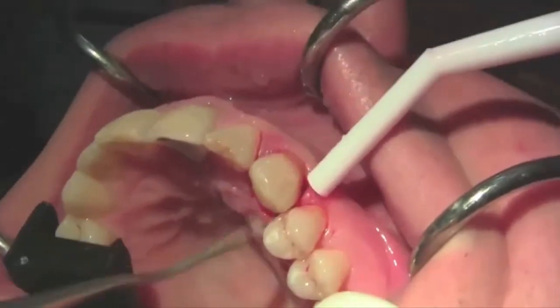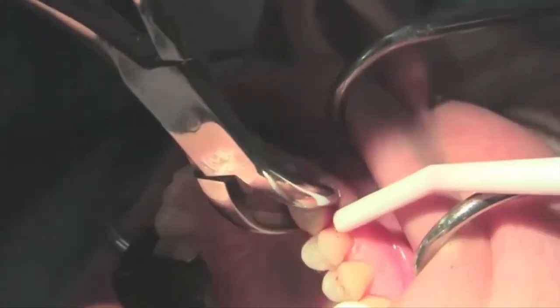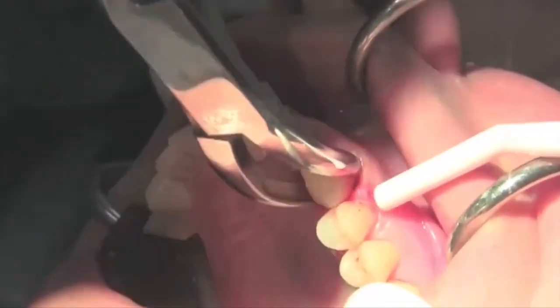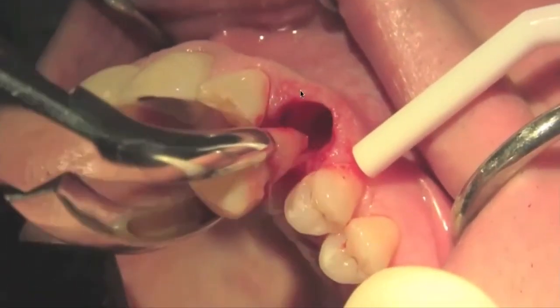And the whole purpose is to actually create that luxation process, and the action of the forceps is specifically for removal. You're going to pick up the root and you're going to get it out without creating any type of forces, because we all know how delicate the facial table, specifically on a canine, is.